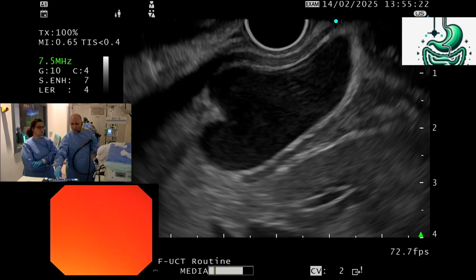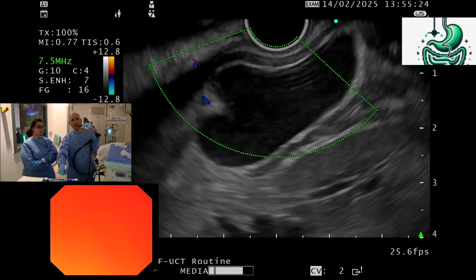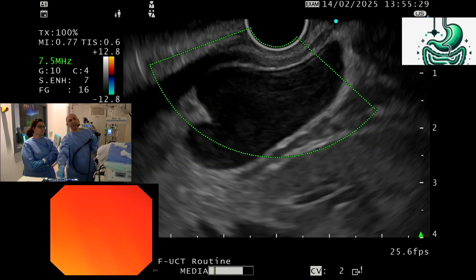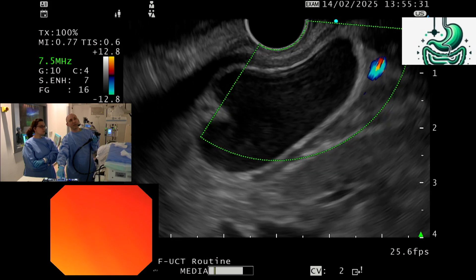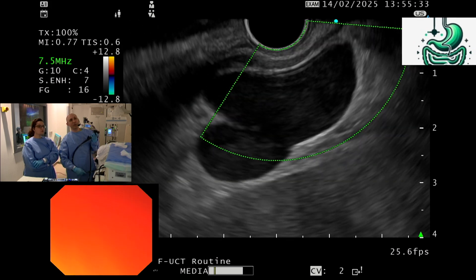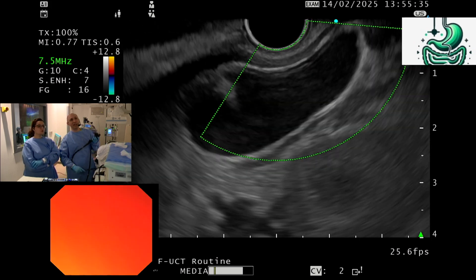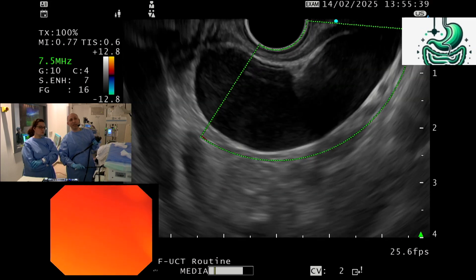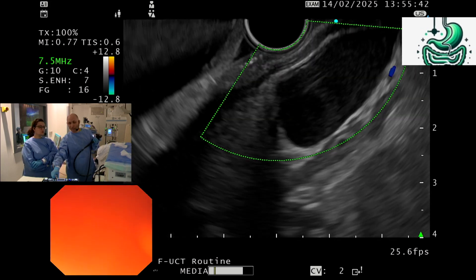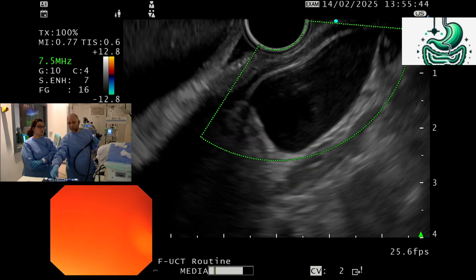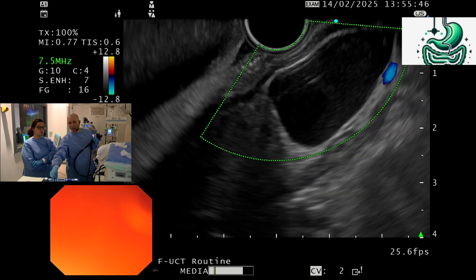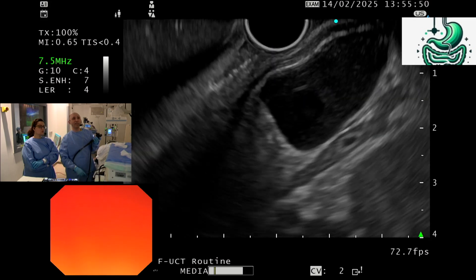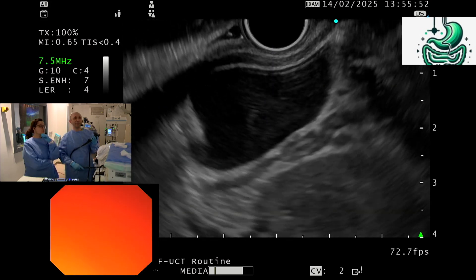One important thing: we can apply the Doppler. Nada, could you comment on the Doppler — do you see any signals? No signals here, so no vessels around. We couldn't see any vessels inside. To my mind, it could be a duplicate cyst, but it's not arising from the gastric wall at the intraluminal site, which would otherwise be a candidate for endoscopic interventions.